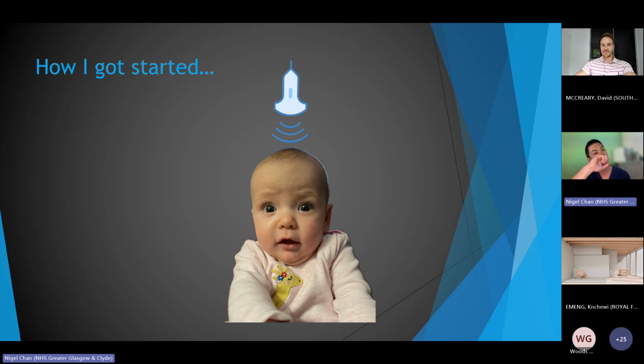So for any pediatricians on the call or in the room, you've probably all done some ultrasound scanning, whether you like it or not. When I first started training as an ST1, we all did cranial ultrasound scans, and it was basically our job on a night shift to do all the day 1, 3, 5, 7, 14 cranial ultrasounds for all the preterm babies.